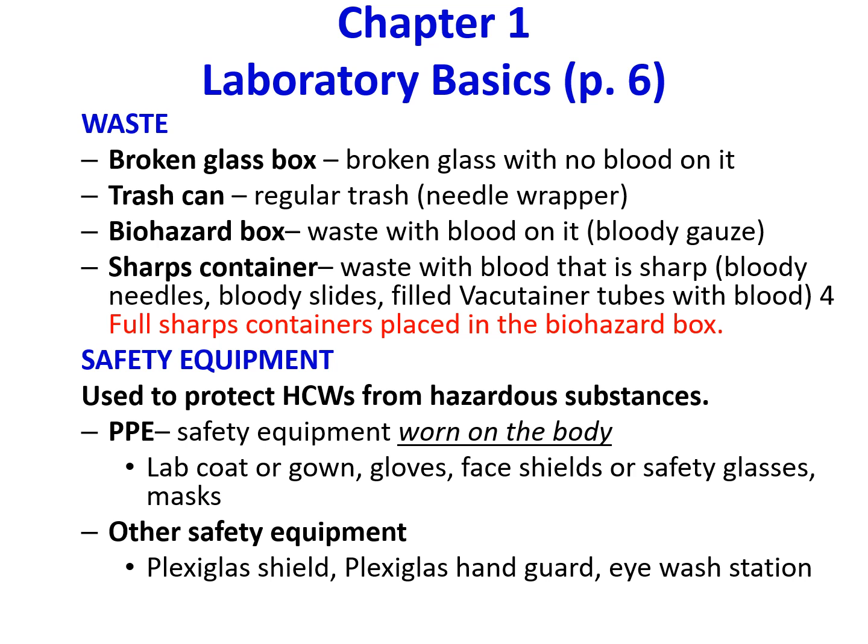Now, when you're in lab with me, we're going to go over where all the waste is. I'm going to show you where the broken glass box is. We have one in the lab. That's where you put any broken glass that is sharp but has no blood or body fluids on it. Then, of course, we're going to have regular trash cans throughout the classroom. That's for the wrappers on your needles, the wrappers on your Band-Aids, things that can go in the regular trash because they have no blood or body fluids on them.